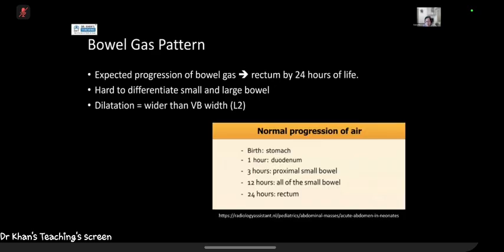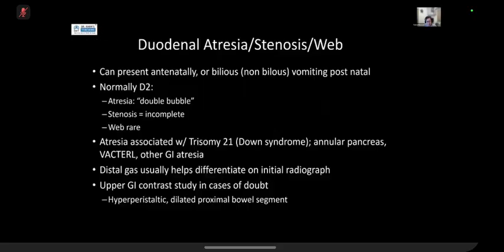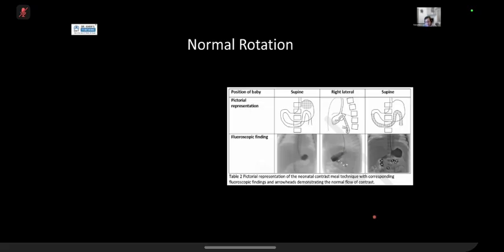Okay, so the next question is, explain malrotation on the lateral view again. Essentially, on the lateral view, the second and third parts of the duodenum should go retroperitoneally, towards the spine, and then it should go up and anteriorly because your DJ flexure is anterior. If I'm not wrong, there is a paper by Alan Daneman from Toronto, and he describes this.